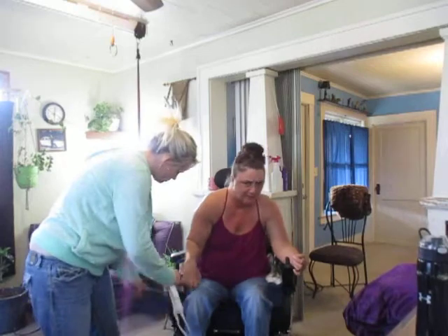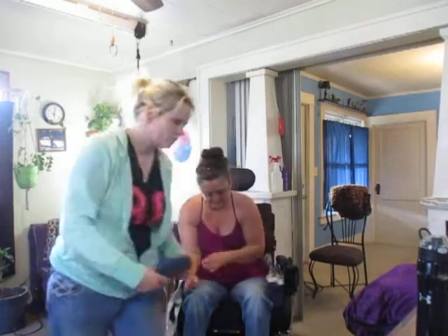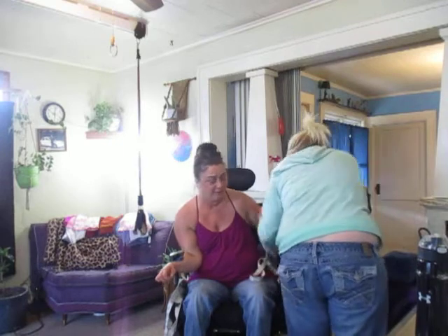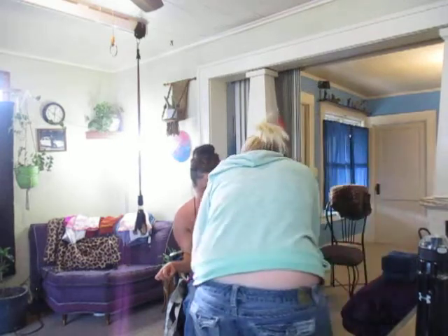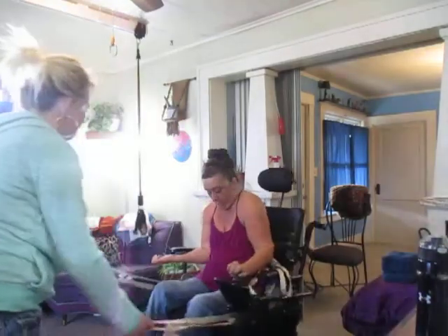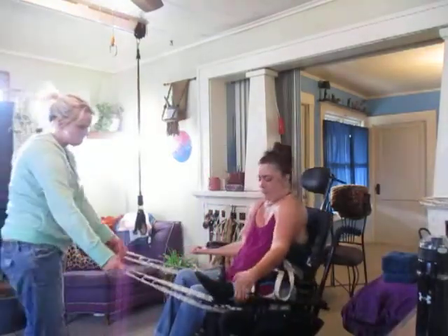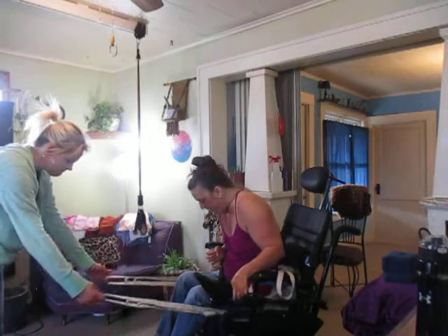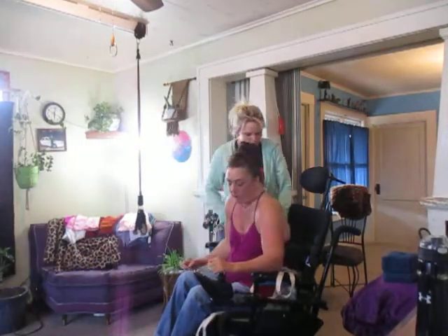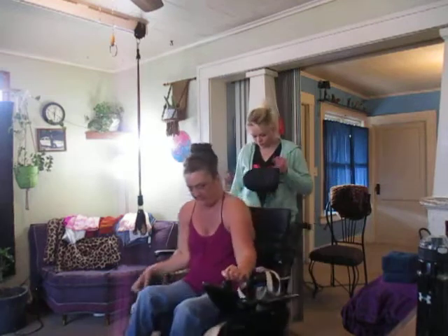Hold on, she's going to be in the way for a minute. I take my nurses with when I go to the doctor's office, because they're pressed for time. Hold on, I'm going to turn. Now I'll have them pull it tight. This butt cheek of mine is smaller than the other, so I always make sure that this side is a little bit longer.